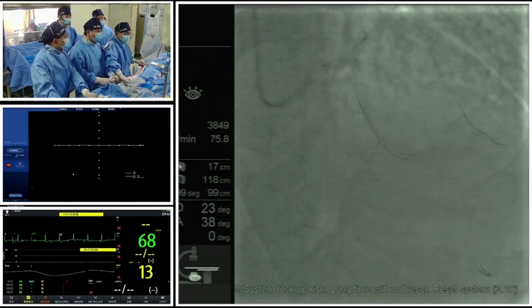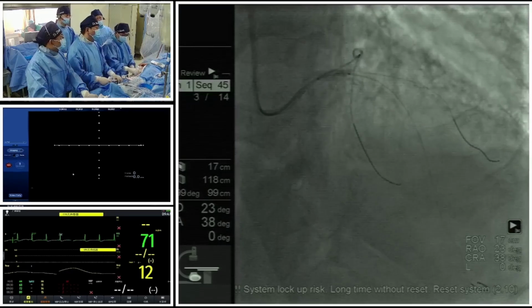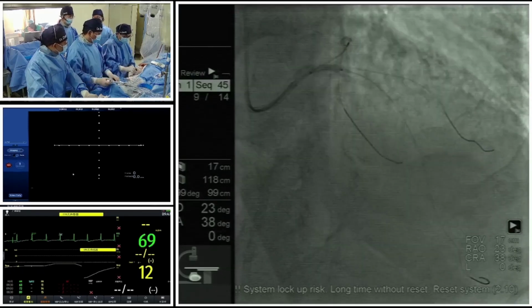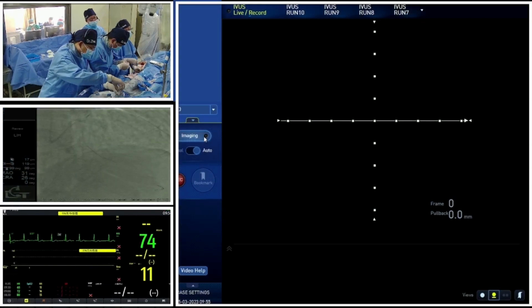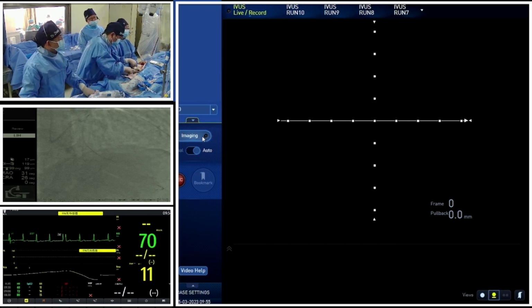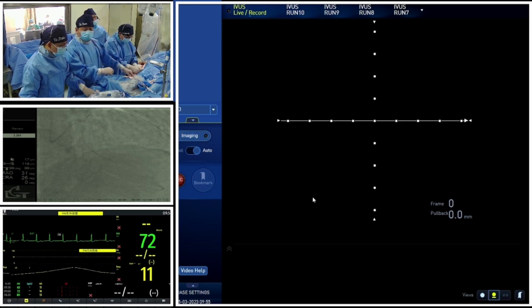You know, to me, the shockwave is kind of new. Before, I thought that when we use the shockwave, we should hear some sound like pa pa pa pa. But actually, there's no sound, right? It's kind of silent. And some doctors prefer to use IVUS, and some doctors prefer to use OCT. So it really depends on personal preference. I think Dr. Gong prefers to use IVUS.